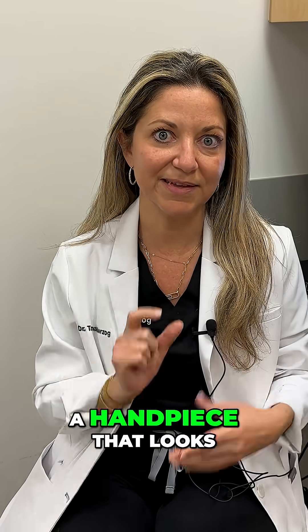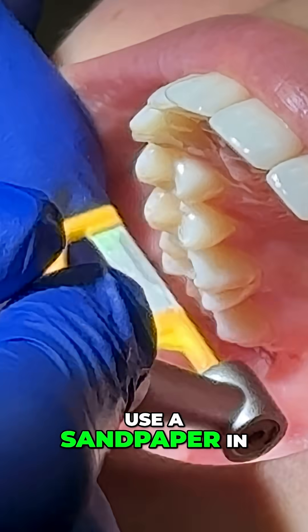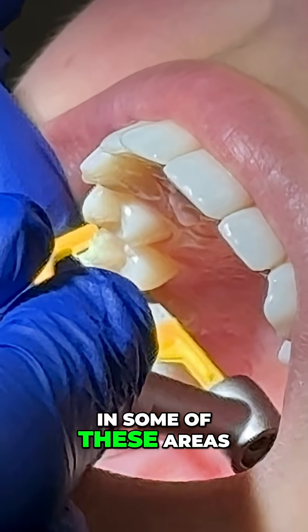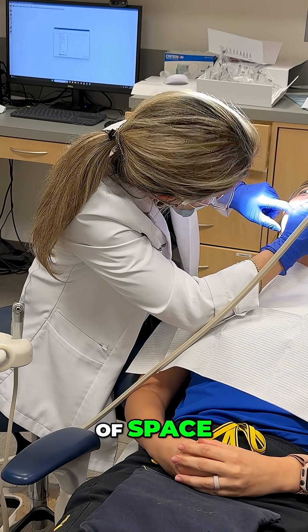And so you're going to see me take a handpiece that looks like a little jigsaw, and we're going to use a sandpaper in between the teeth to make space. In some of these areas, we're only making about a half a millimeter of space.